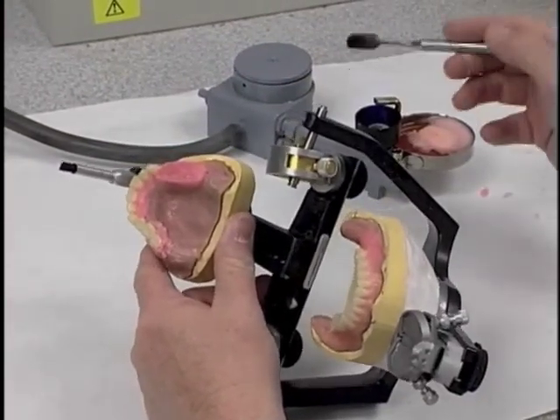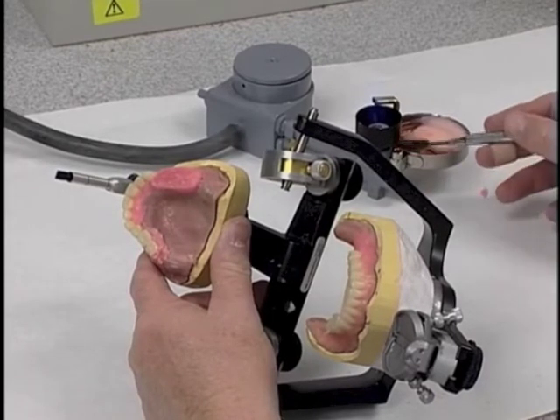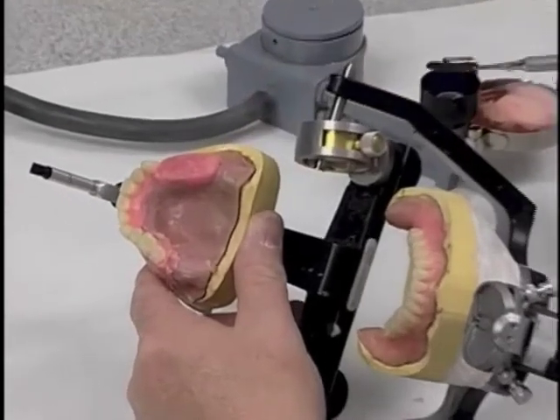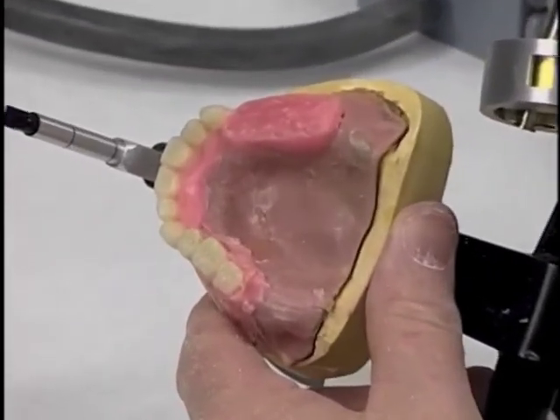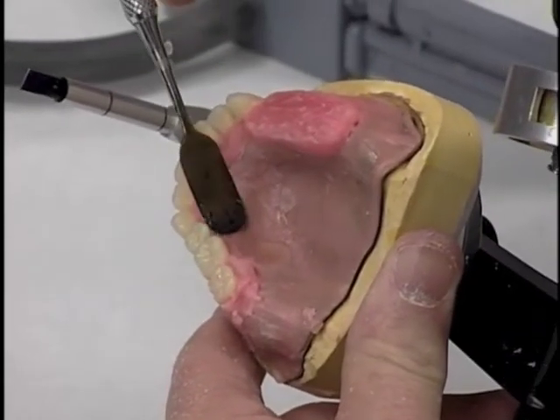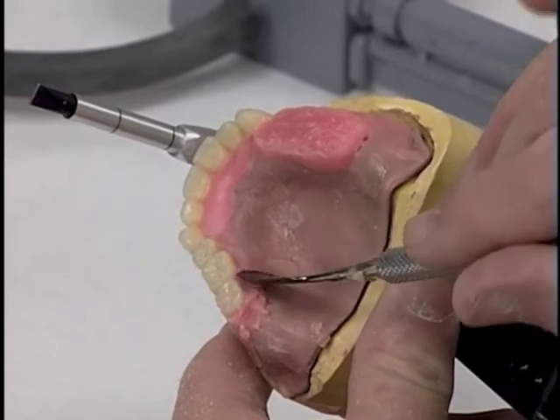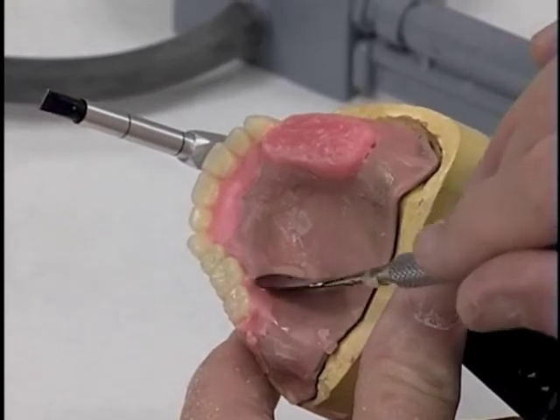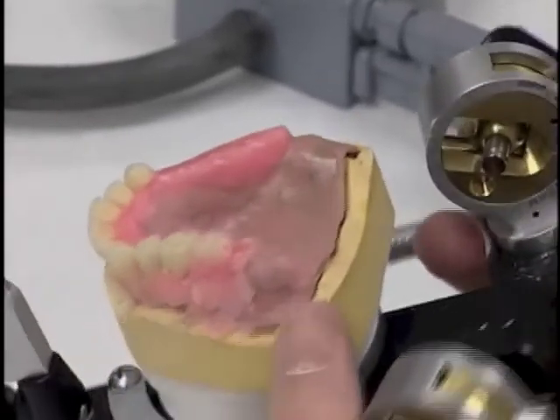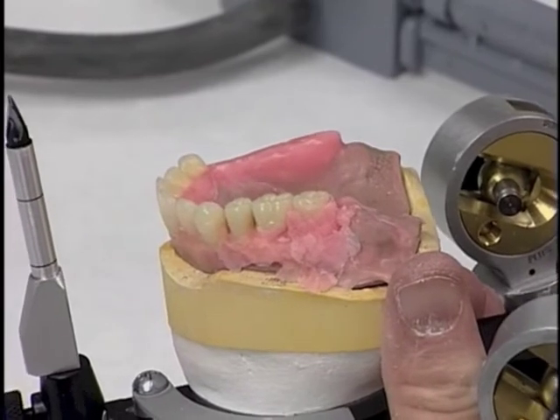So let's stabilize the teeth by flowing wax around them. And we'll stabilize them on the buccal a bit.